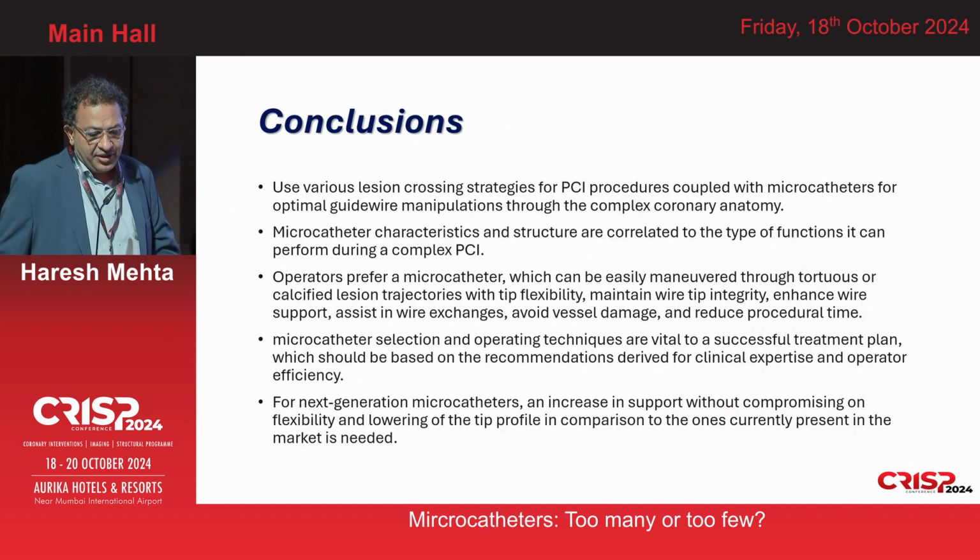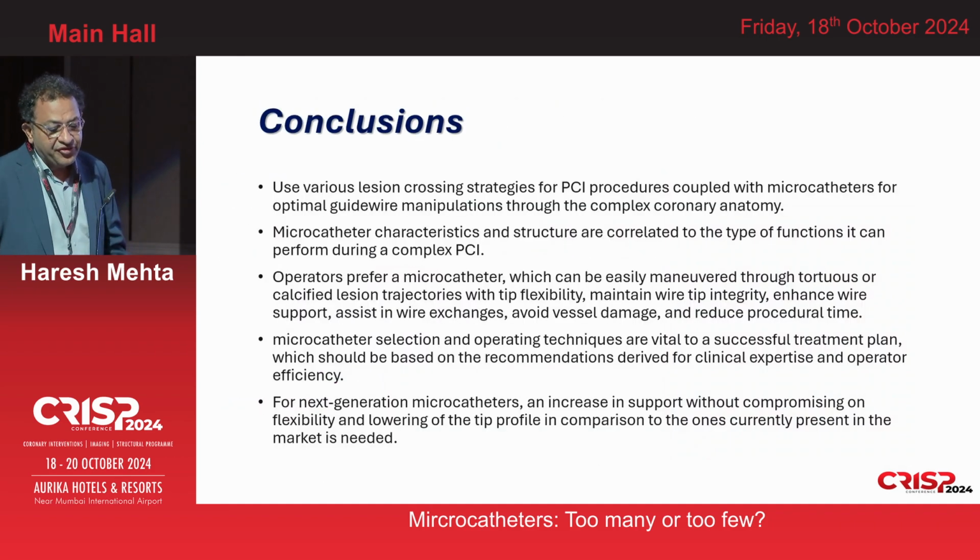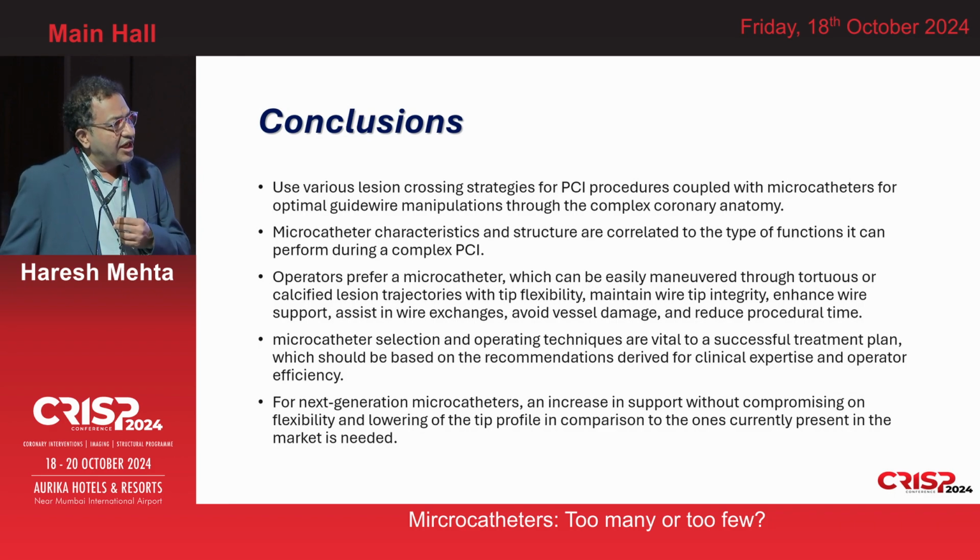So the summary slide would be, every lesion is different. These catheters have made life easy for us. We can cross any type of vessels nowadays. We can manage more and more composite lesions. Select your microcatheter very wisely and your job is much easier.